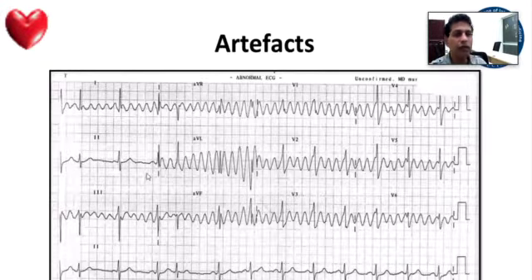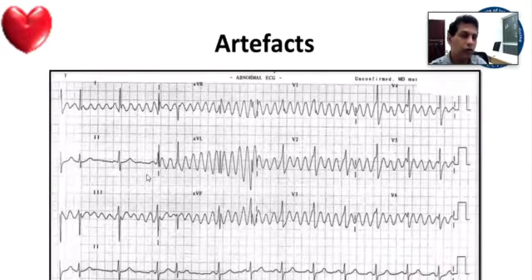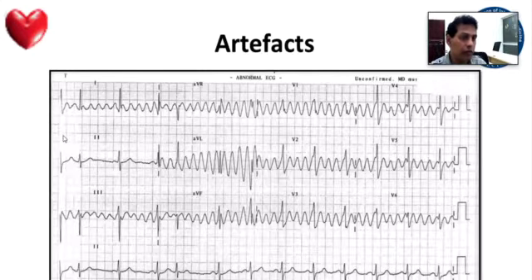So I have several ECGs collected, especially when you do ECGs on Parkinson's patients, or people who have anxiety and are excited, they develop a lot of muscle tremors. As a result, you get these artifacts. So they are normal. So pay attention to artifacts also.